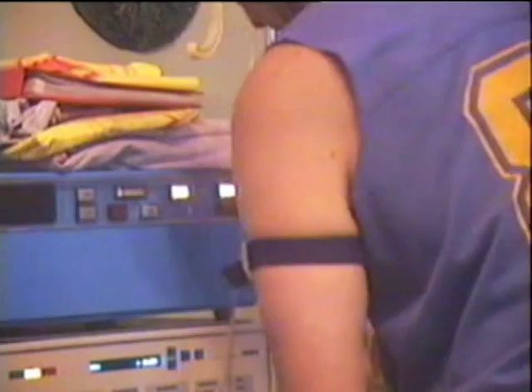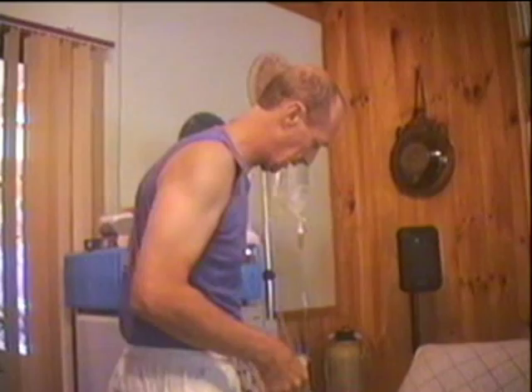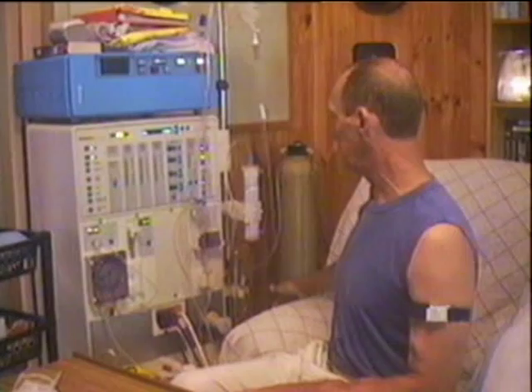Let's see how all this works once the blood completely flows through it — the other side of the kidney. For the time being, it's got a bag on it. This bag is for the initial priming — to prime all these lines with saline to get all the air out. We don't want any air in there to go into your body. That's the lines all on for the time being, while the machine is still doing its rinse cycle. Now what I have to put on is a heparin pump.